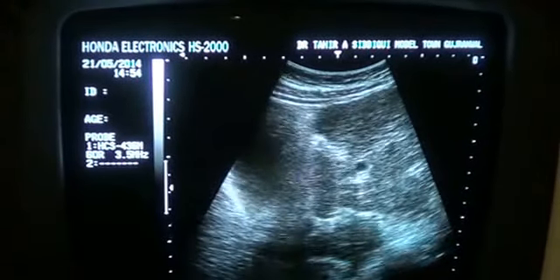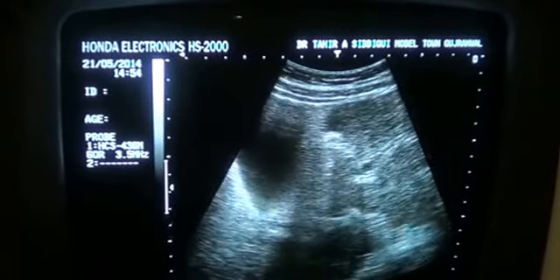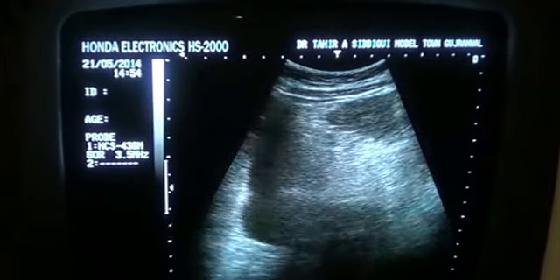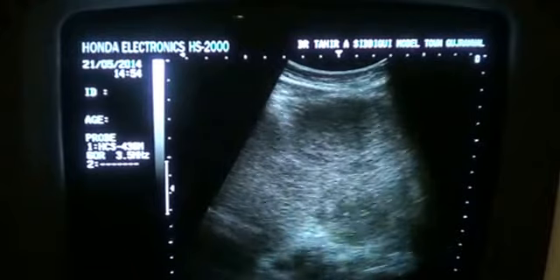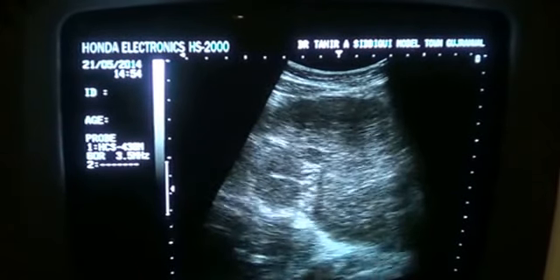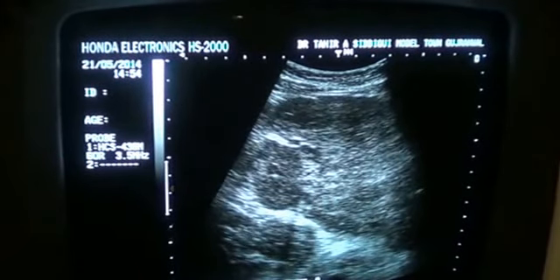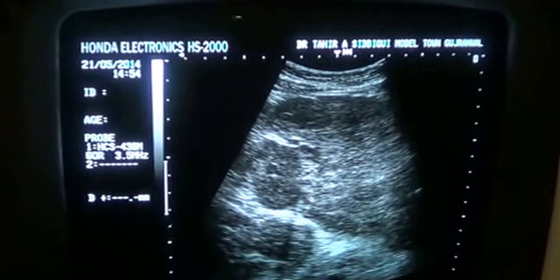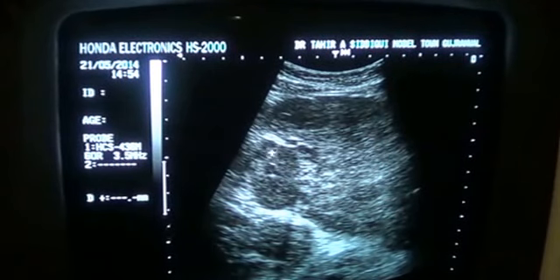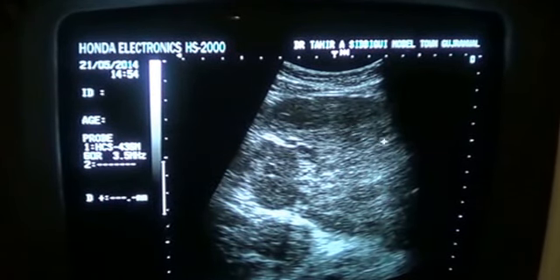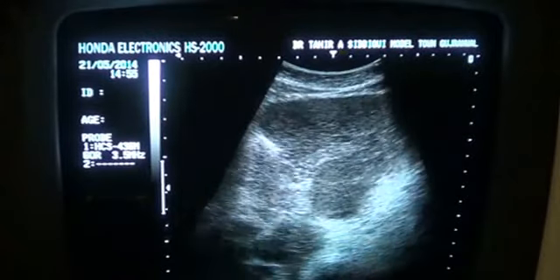This is the transverse section of the same liver. You will see that this is the region that is communicating. This is the caudate lobe, this is the focal lesion that we were seeing, and this is the left lobe of the liver in transverse section.